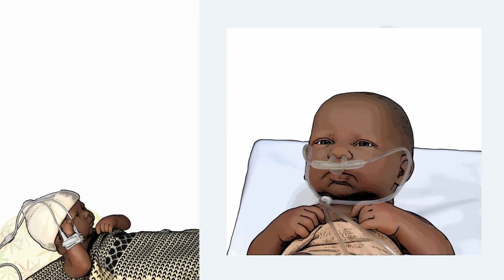The second is to place the prongs behind the ears, like this. Be sure to bring the slider up gently to the neck and don't do it up too tight. Once again, secure with plaster.